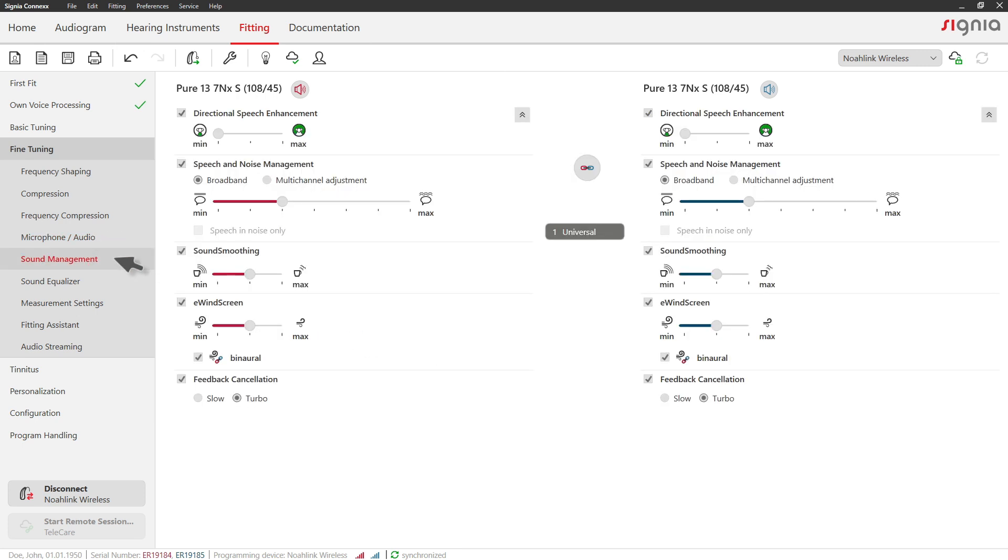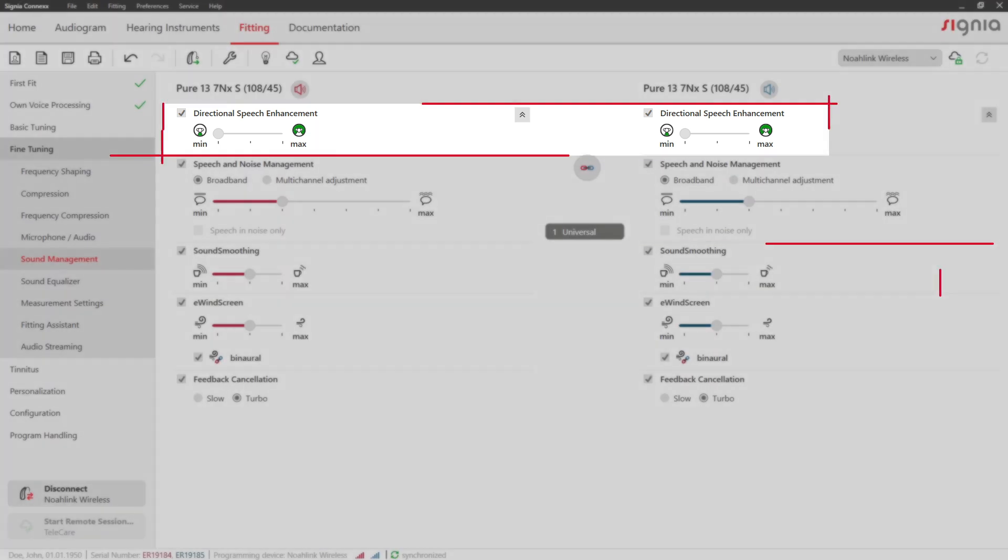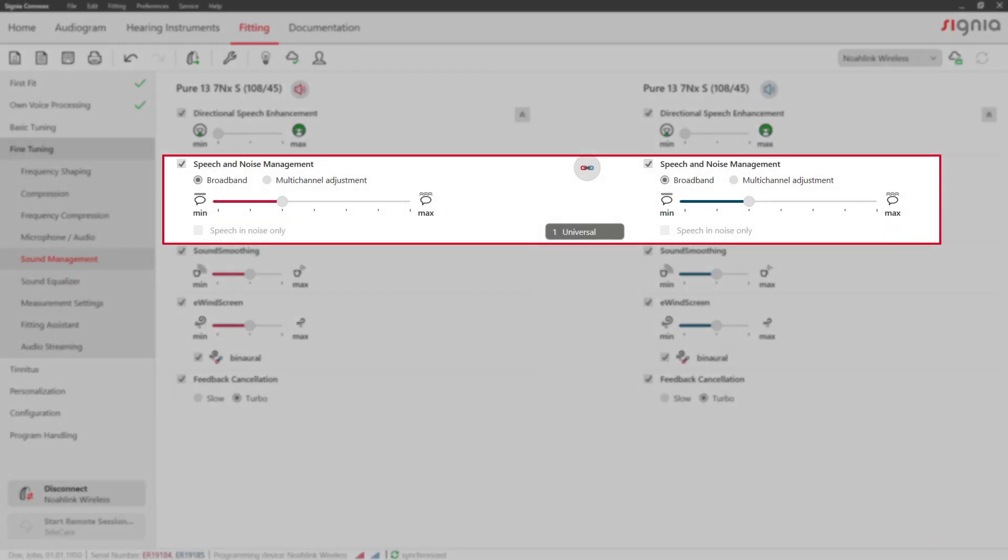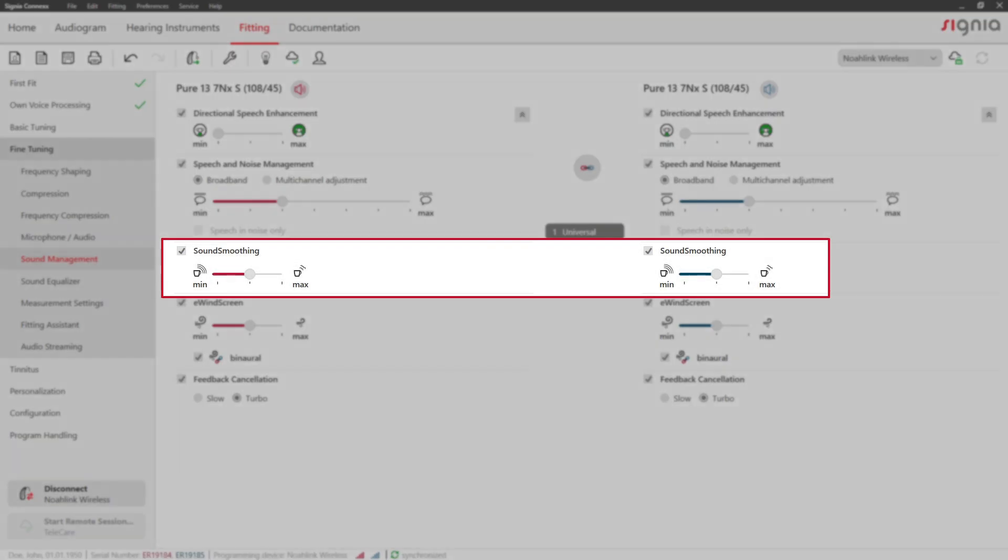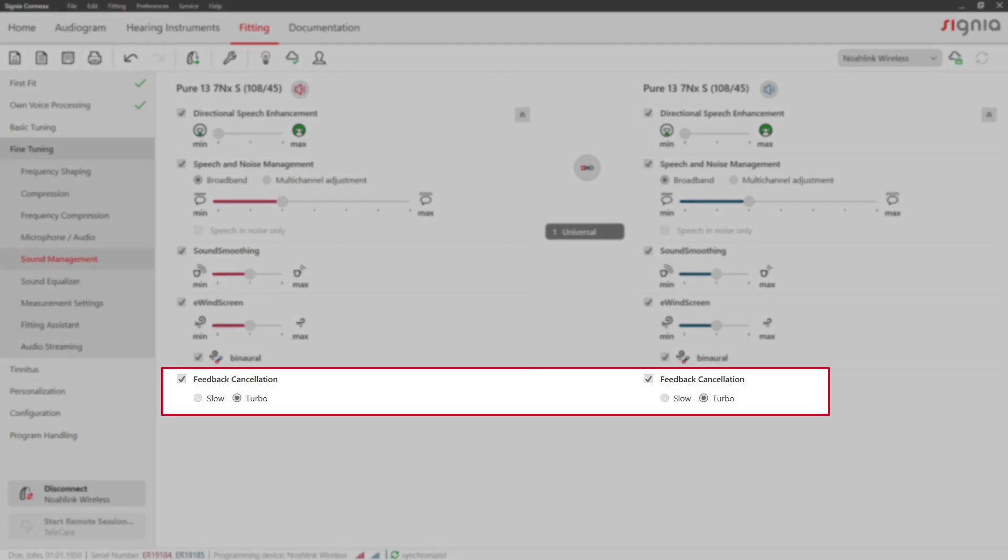In the Sound Management tab, you can adjust noise reduction settings like directional speech enhancement, speech and noise management, sound smoothing, e-wind screen and feedback cancellation.